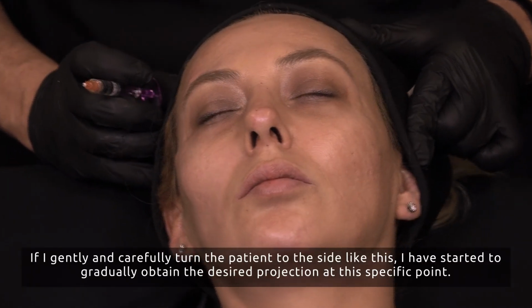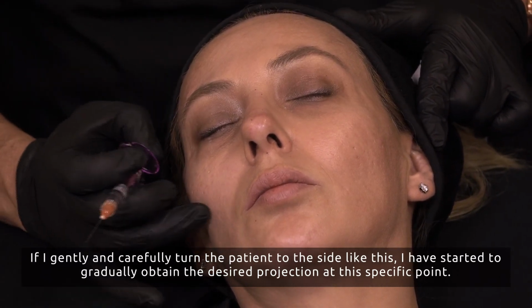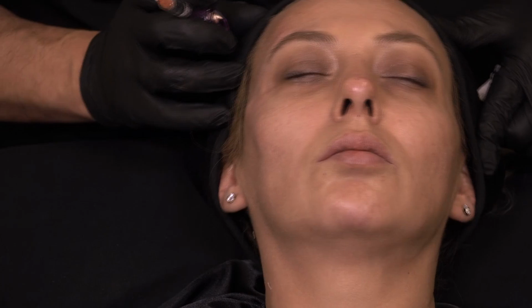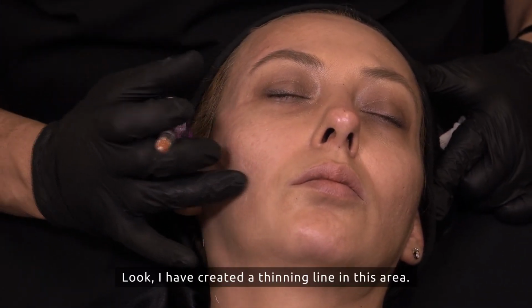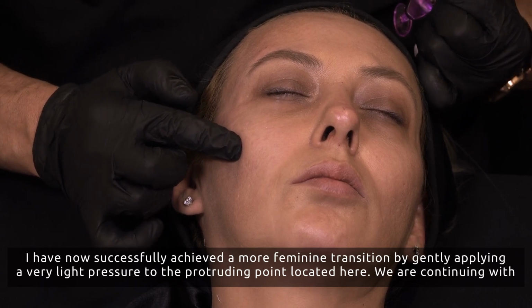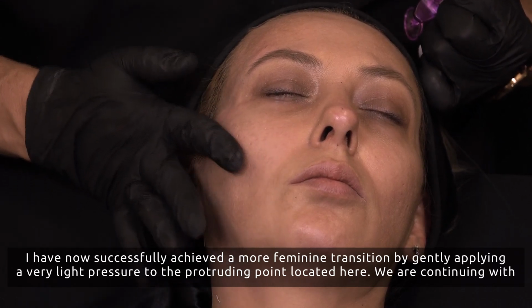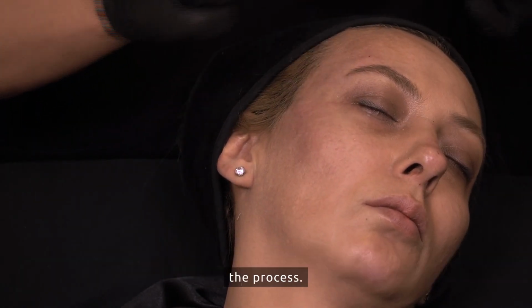If I gently and carefully turn the patient to the side like this, I have started to gradually obtain the desired projection at this specific point. I gently turn the face back to the front. Look, I have created a thinning line in this area. I have now successfully achieved a more feminine transition by gently applying a very light pressure to the protruding point located here. We are continuing with the process.